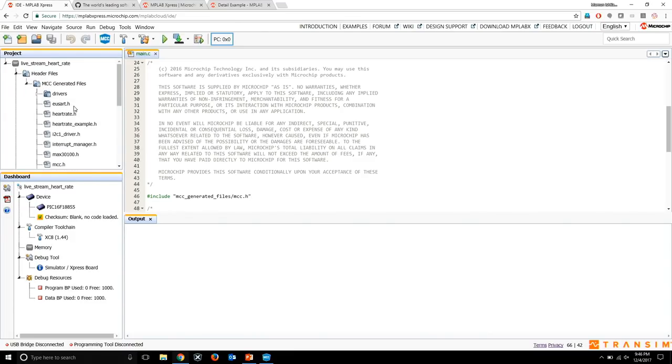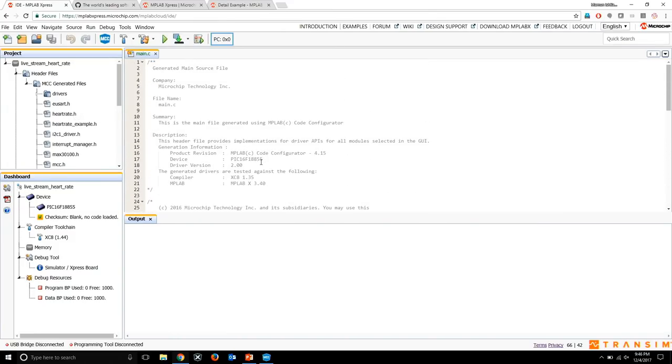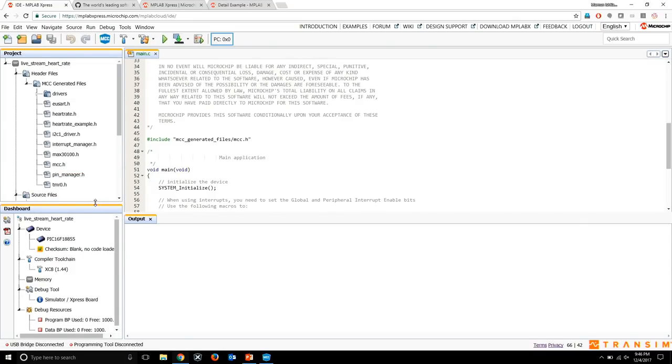I mean, look at that. MCC has done all of this for us already. It's fantastic. That is fantastic. And that's pretty quick. If we didn't have it, you'd be done. There is a lot of code in there.